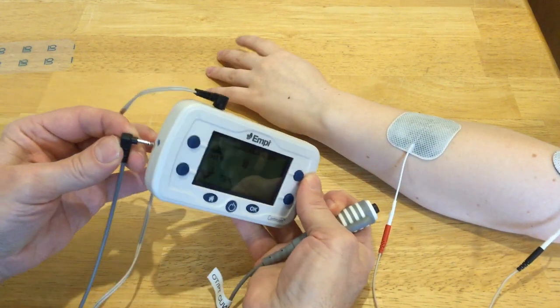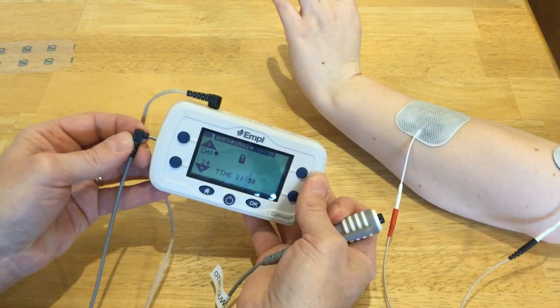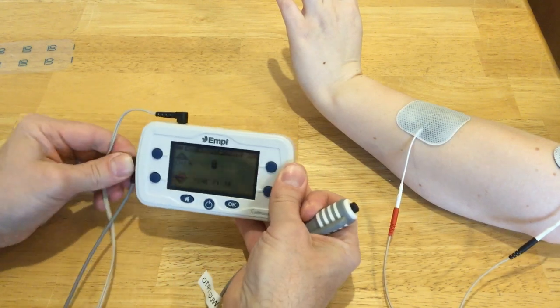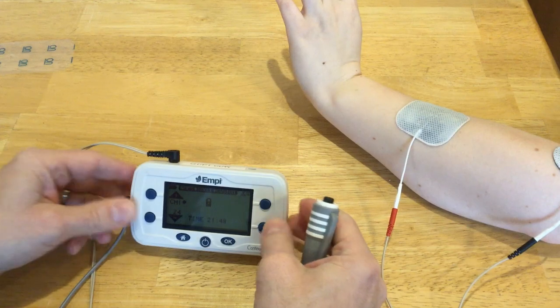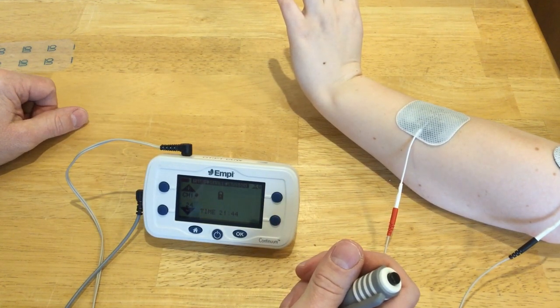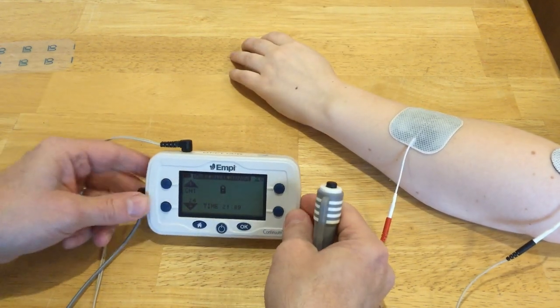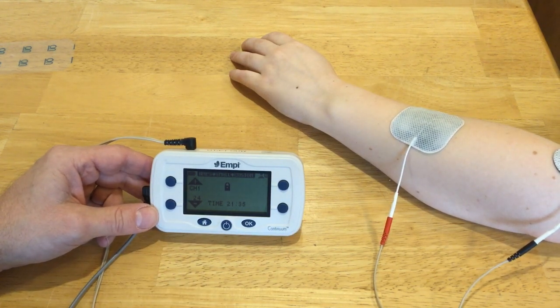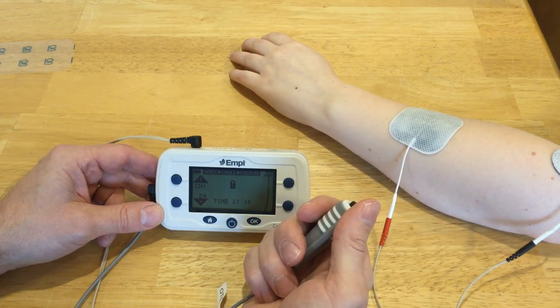This unit has a little port inside where I can plug that switch in. Once I've put that switch in, my on-off time that I set in the machine has been deactivated, and the switch now controls the on and off.